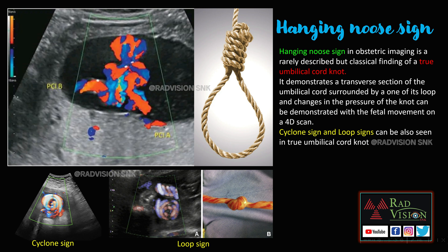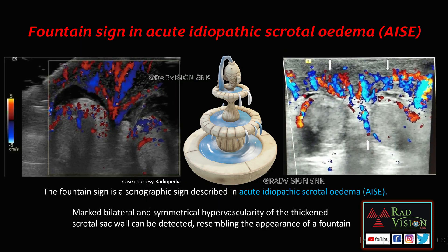Next, what is the fountain sign? The fountain sign is classically seen in acute idiopathic scrotal edema. Here you can see there is diffuse thickening of the scrotal wall, and on color Doppler you can see bilateral symmetrical hypervascularity of the thickened scrotal wall, which makes the fountain — that is, water flowing out of the fountain. This is bilateral symmetrical hyperemia noted in the thickened scrotal wall seen in acute idiopathic scrotal edema.